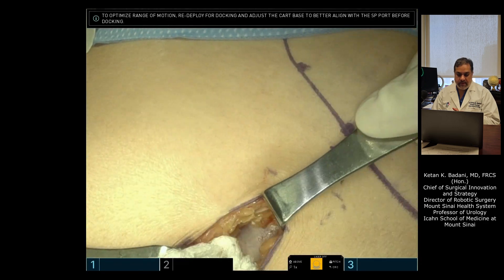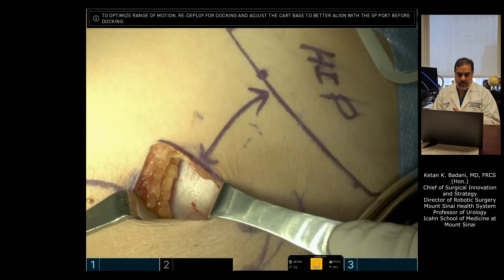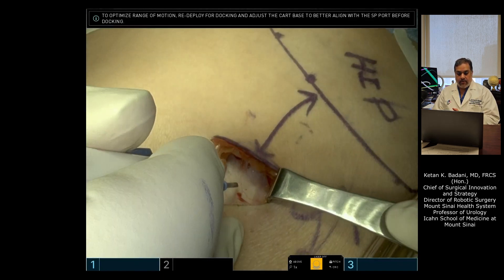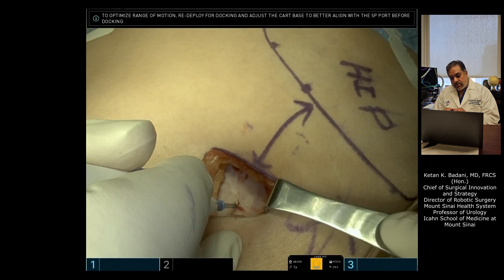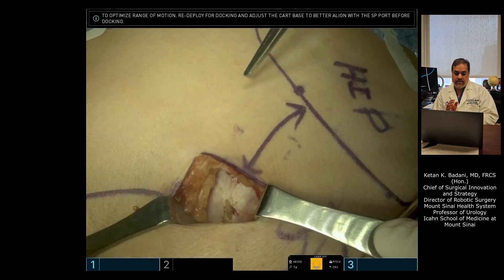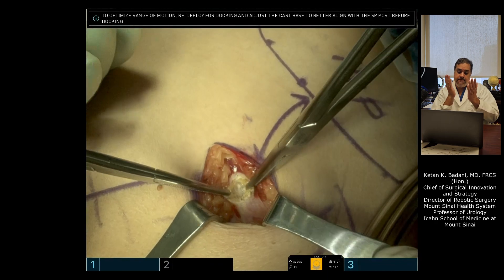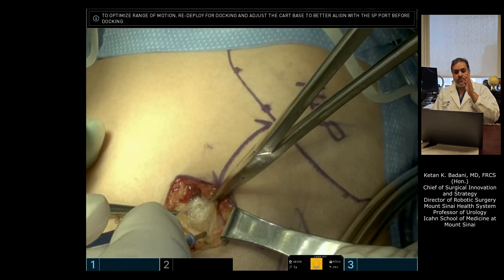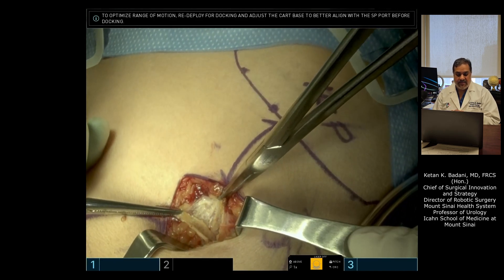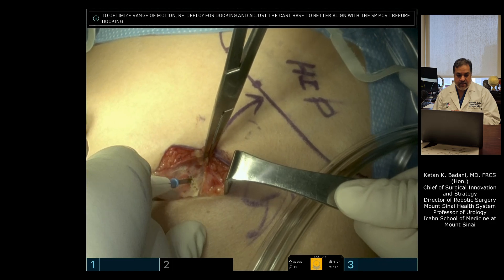This is external oblique fascia. Once you have external oblique fascia, you can make a small incision into it and grab it with Kochers. A small tip: you can skive towards the kidney a little so that your skin incision and your fascial incision are staggered towards your target organ. It helps with instruments coming in and out — we're talking millimeters here. Then cut the external oblique fascia and split the external muscle.